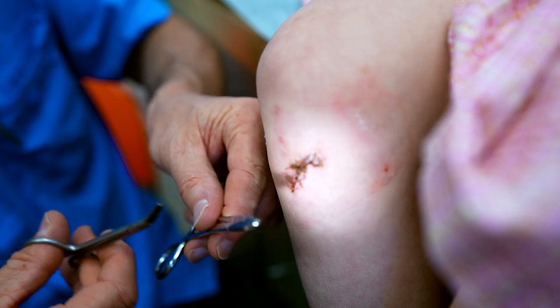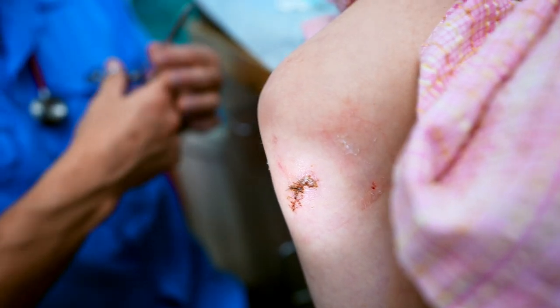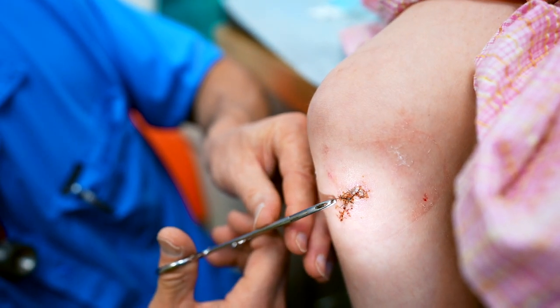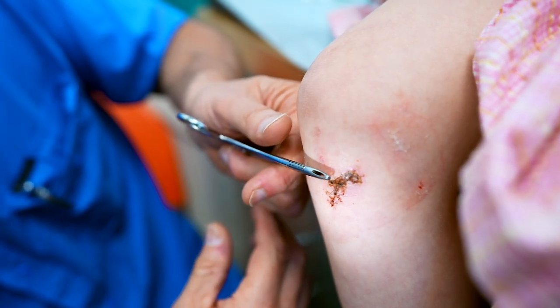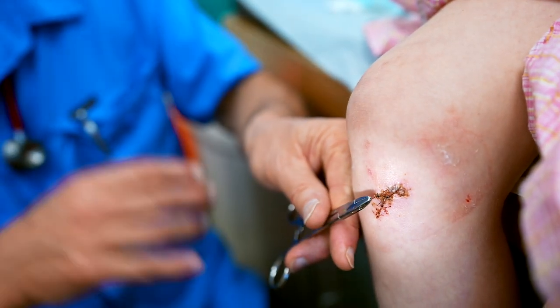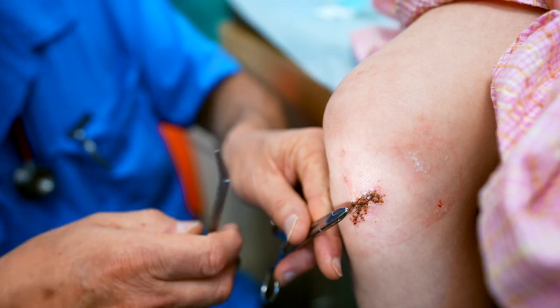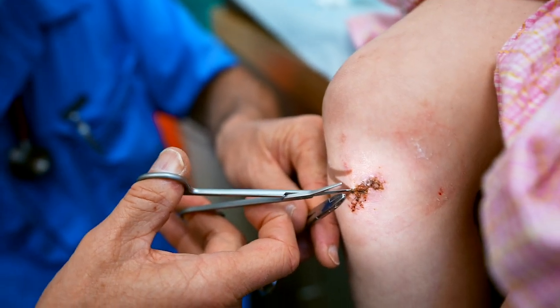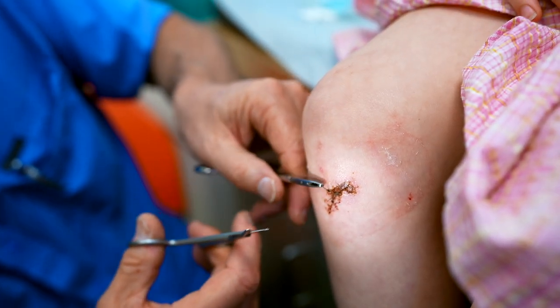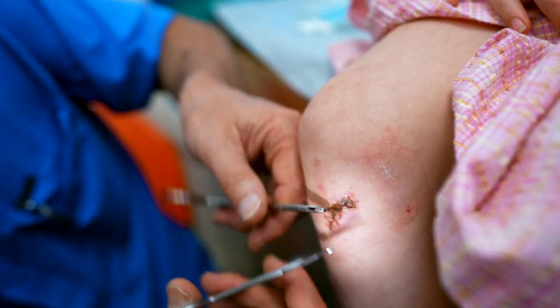It's hard to find good nurses. The real reason is I haven't been practicing for seven months — I was just joking. So it's been probably a year since I've taken stitches out. You're my most favorite light holder of the day, by far. Actually, of the week. Actually, of the month. Actually, you're the best light holder I've had all year.